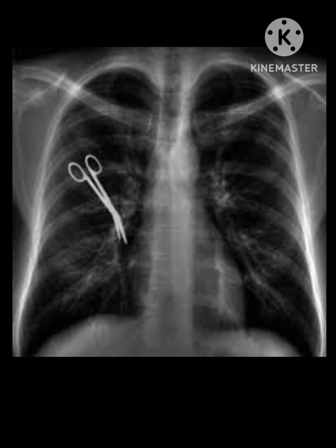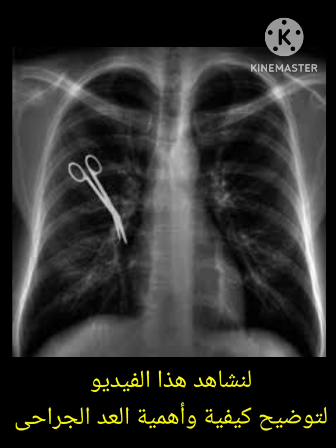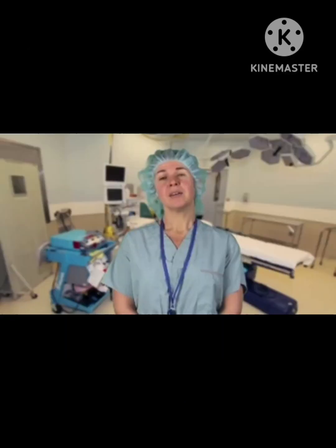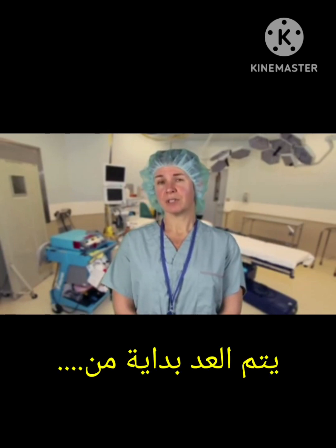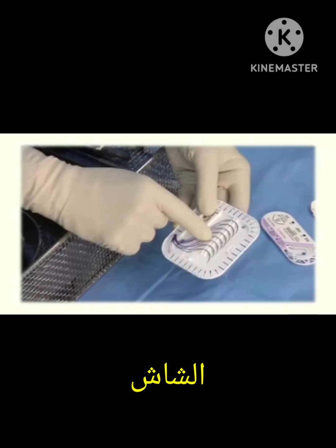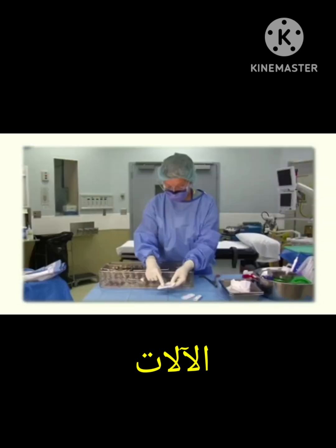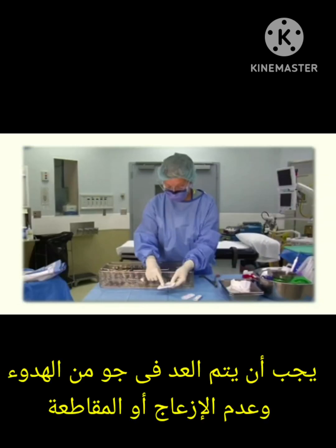The surgeon also needs to inform the patient's family. The circulating nurse will note on her file that the count is not correct and must initiate a report. Now let's see a video on how to do the surgical count. Having a systematic and routine approach to counting will help you learn this skill and perform it effectively. The accepted routine is to begin with sponges, then count sharps, miscellaneous items, and finally instruments.